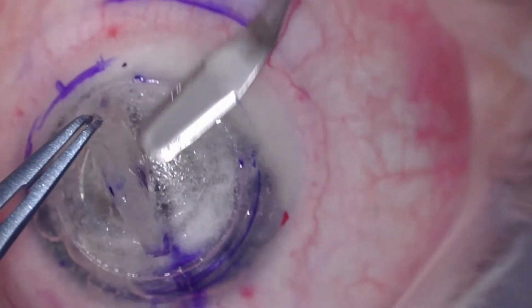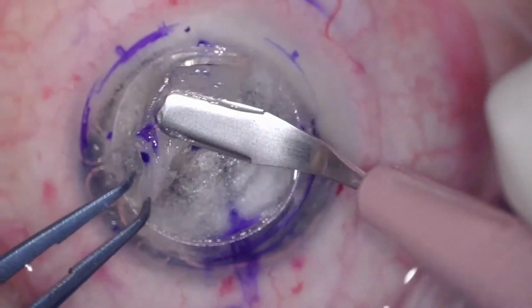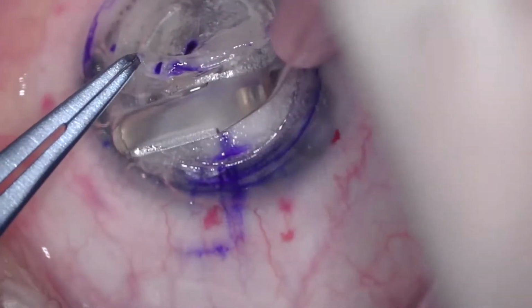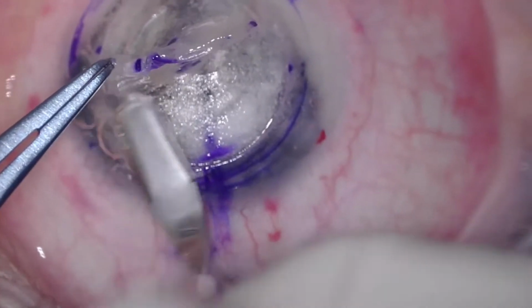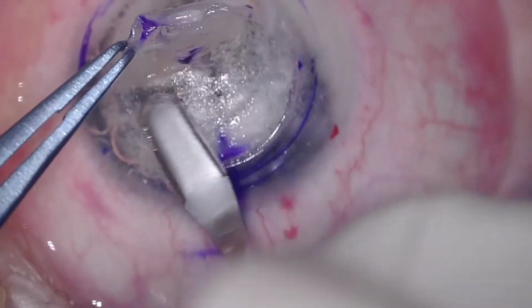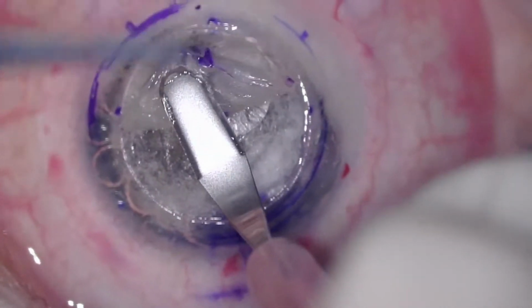The other question is whether it's more difficult to do deep anterior lamellar keratoplasty in patients who've had corneal cross-linking. In my experience, I find the suturing actually easier in patients who've had previous cross-linking. The initial trephination feels more crisp, but with cross-linking patients, the usual depth of cross-linking is around 300 microns, and you're usually going deeper than that when you're doing a deep anterior lamellar keratoplasty.